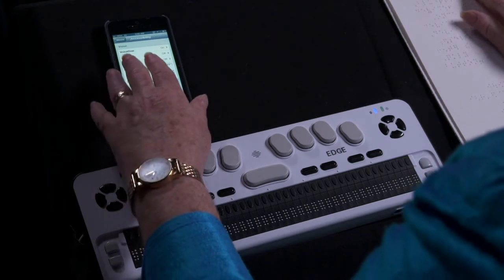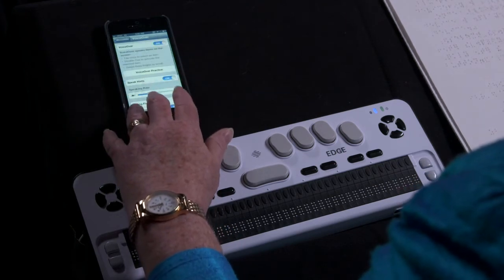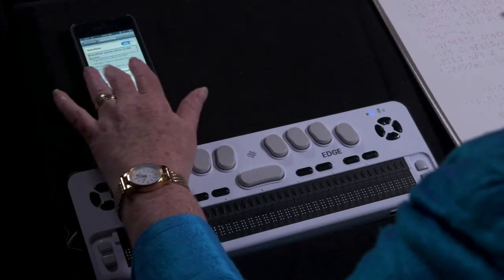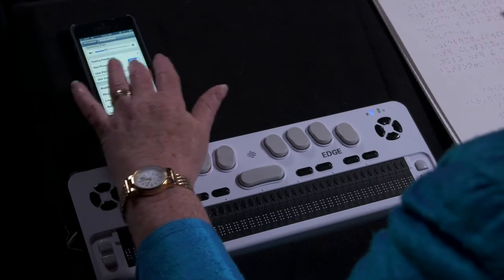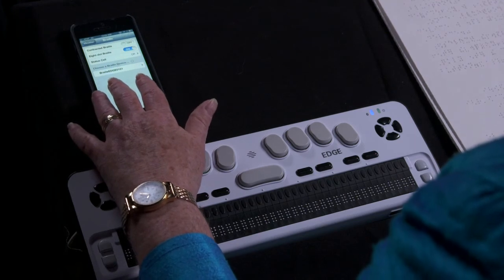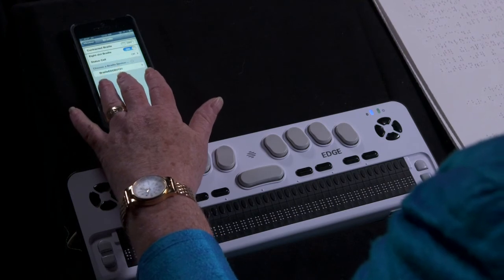Then select VoiceOver, then Braille. Inside the VoiceOver settings, scrolling past options including Tap Off, Double Tap, Swipe, Speak, Type, Use Phone, Use Pitch Change, Use Compact Braille, and Rotor — then select Braille. Contracted Braille is currently set to Off. Double tap to toggle setting.